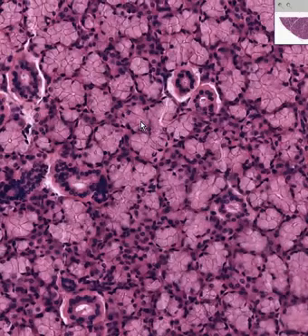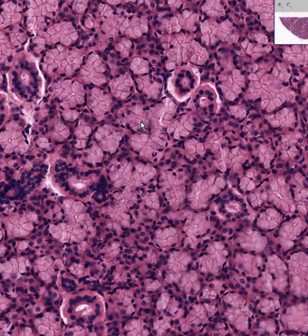And remember, in a mucinous or mucus acinus, which is predominantly mucus for lubrication, the nuclei are displaced and flattened at the base, and the cytoplasm is chiefly very, very watery.